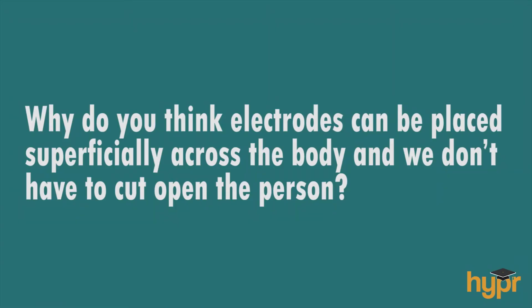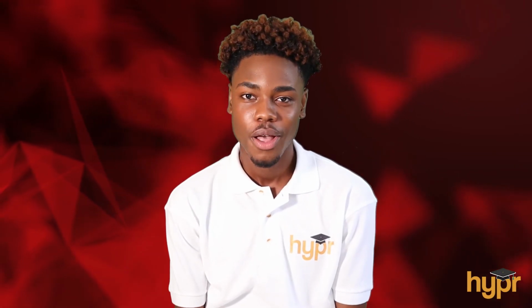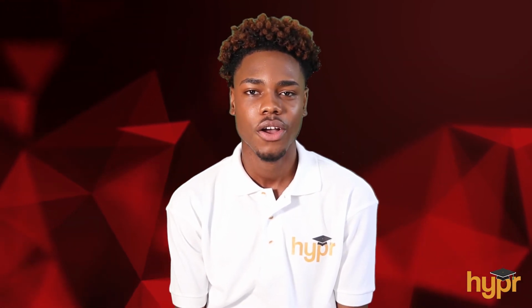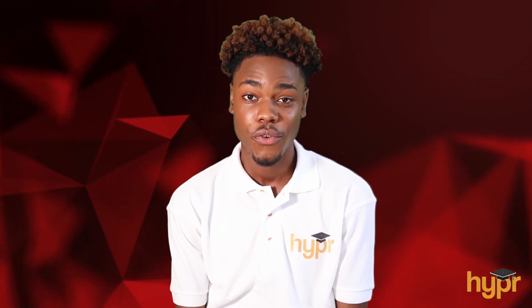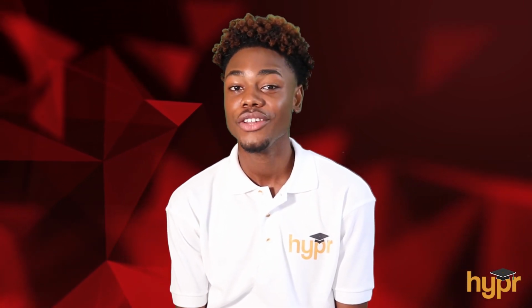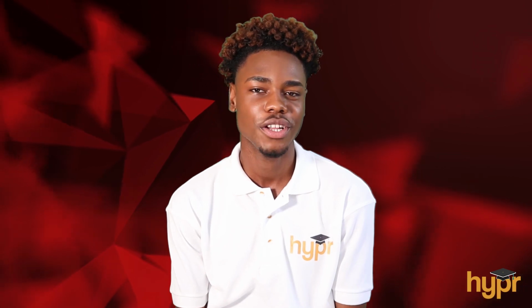Question: why do you think electrodes can be placed superficially across the body and we don't have to cut open the person? Well, for one, practicality, and two, the body is filled with fluids that contain electrolytes, and therefore the body can function as a volume conductor, transmitting electrical waves towards the superficial surfaces.